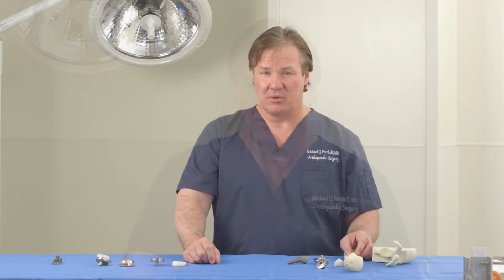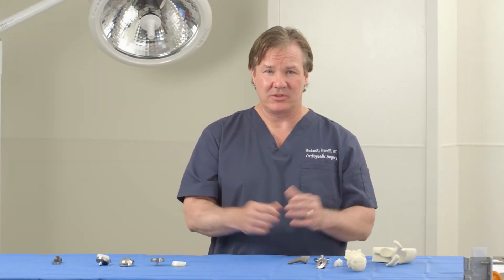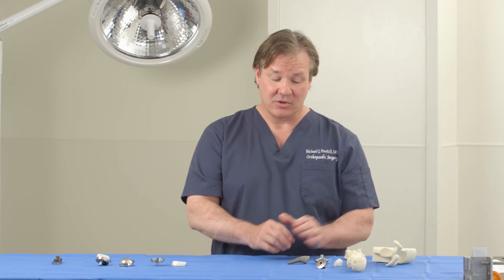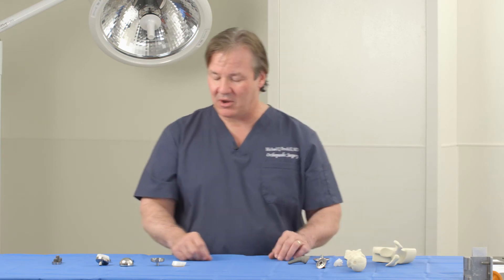In order to have an anatomic total shoulder, your rotator cuff has to be in working condition. The rotator cuff is a group of tendons around the shoulder that help us raise our arms in certain positions. For this type of implant to be utilized, your rotator cuff has to be in good condition. If not, you receive a different type of shoulder replacement called the reverse shoulder replacement.